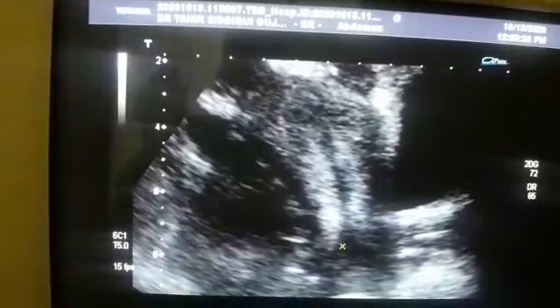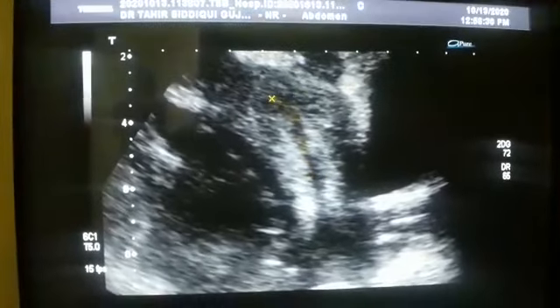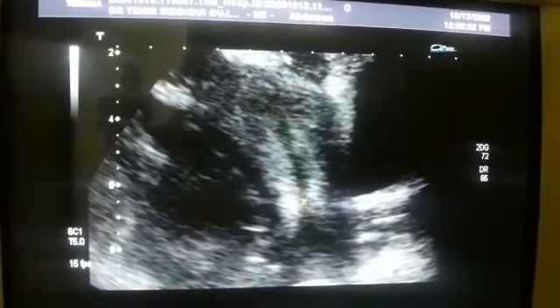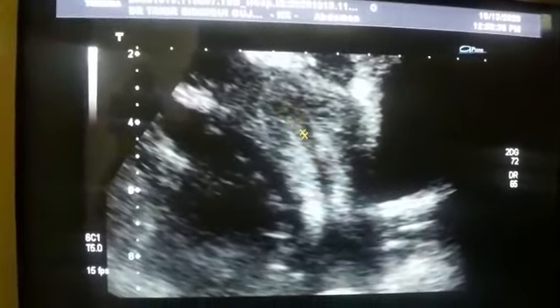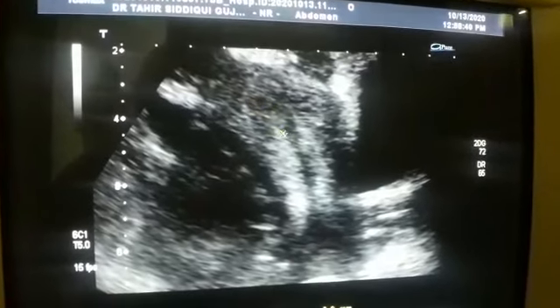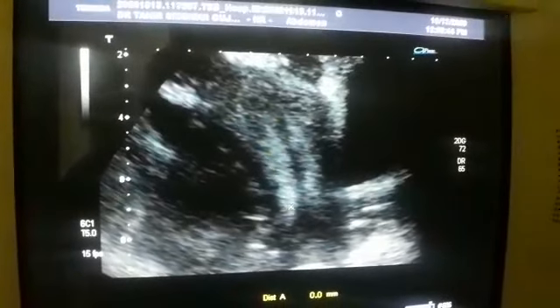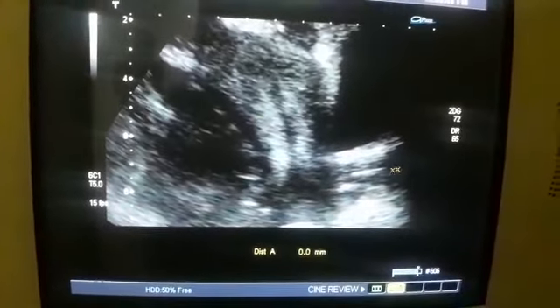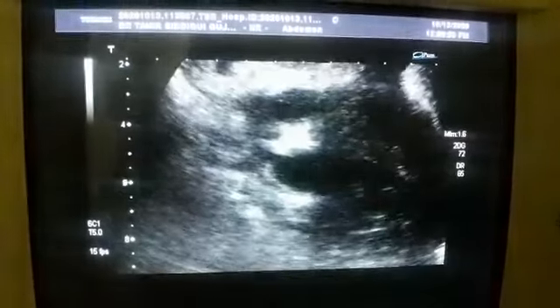This area that you are seeing is the uterus. And this is the endometrial canal. You can see that there is fluid within it, and this part, or the cephalic part of the endometrial canal, contains echoes. So this is bleed, in fact, and this is the cervix. This is the vagina. So if this is clear, then let's move on.